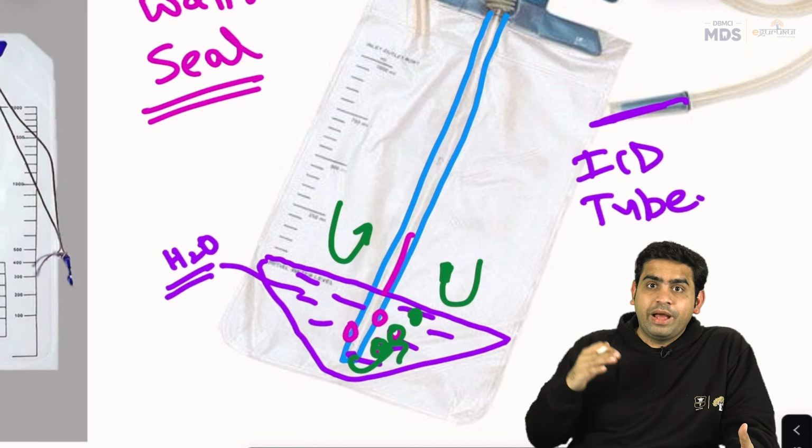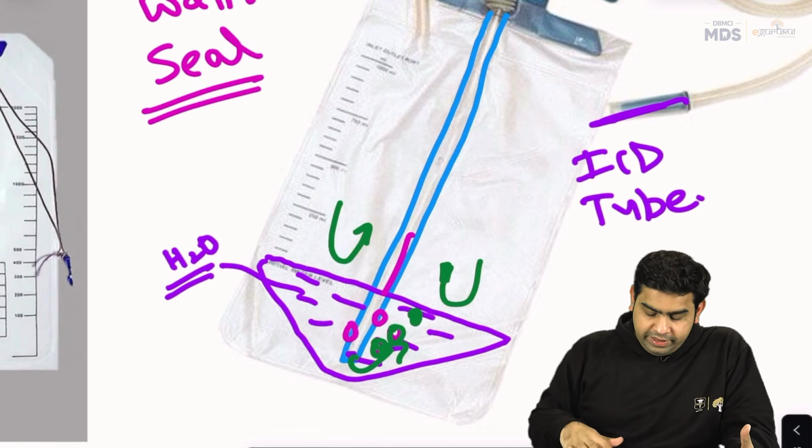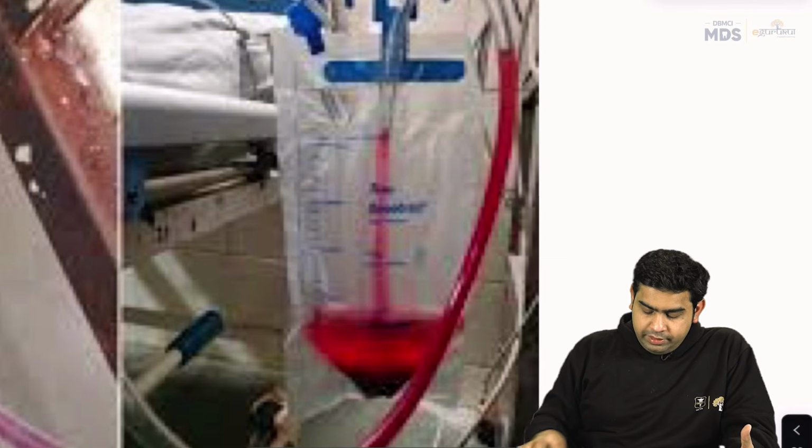ICD bag and the Euro bag are different. I hope you are able to appreciate these points. Perfect. Right. Okay. So this is the ICD bag in one of the patients.